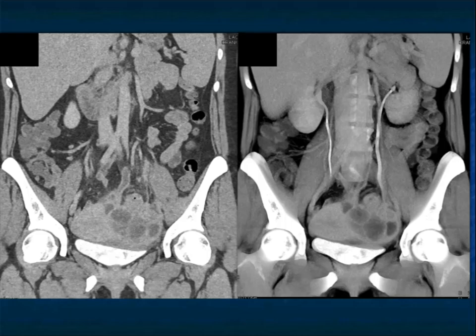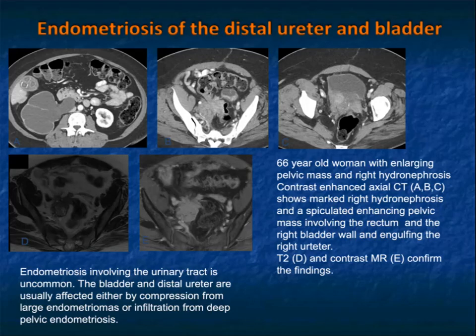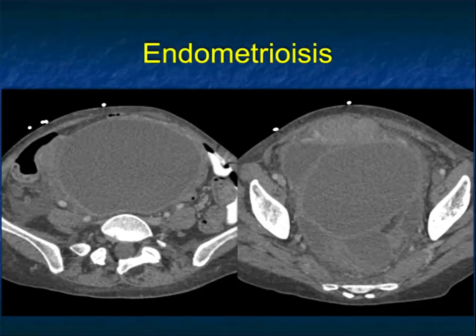Endometriosis can involve the urinary tract. In this case, it involves the ureter on the left with no obstruction. In another case, endometriosis on the distal right ureter is causing obstruction — you can see hydronephrosis on the right with marked thinning of the cortex. You might think of a longstanding stone, bladder cancer, or some pathology of the right kidney, but endometriosis was the right answer.